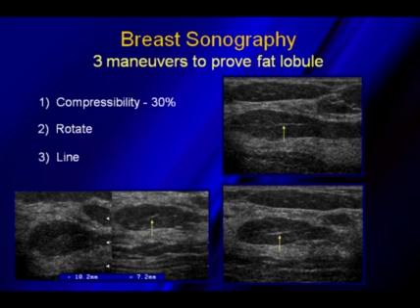Anywhere that I have compressed, you can see this white line. Now, if you lighten up your pressure, the white line will go away. Compress down, it'll come back. What this is, if you've ever seen fat, fat's not just a sheet in there, it's one glob of fat up against another. So what we're doing is catching the interface of one fat lobule against the other one. If you lighten your pressure, the interface runs up at an angle so that we're not seeing it, but as you compress down, one interface to the other, you are now scanning that at 90 degrees, so you're able to see the interface from one fat lobule to the other.